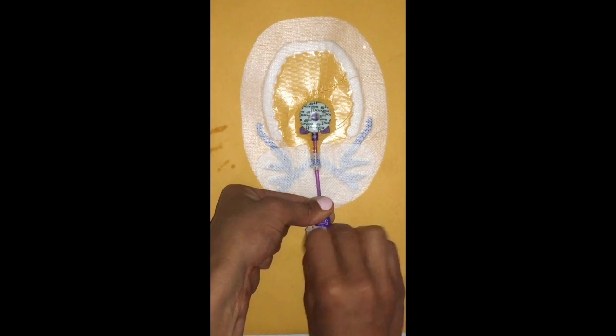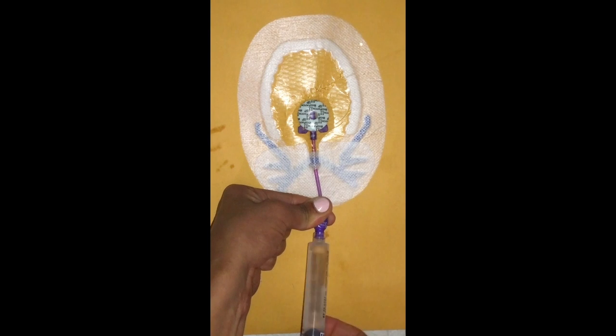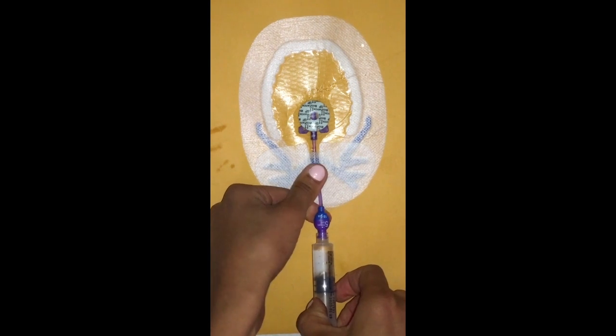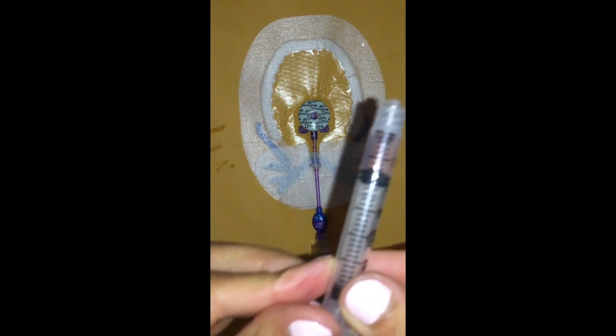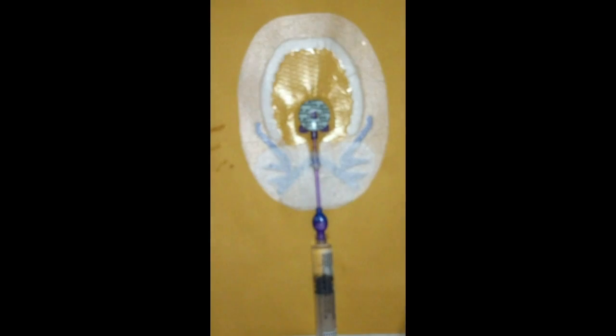Then you're just gonna scrub the hub again, and you're gonna take a saline flush. At this point, your line is just filled with blood, so you wanna flush that clear. So we're just gonna flush that. And now we're gonna determine our prime volume. So if you look here, it looks as though our dwell volume is 0.8. So that's 0.8 mLs. So we're going to take 80% of that to use as our prime volume.